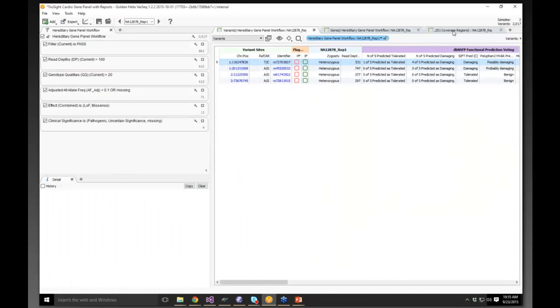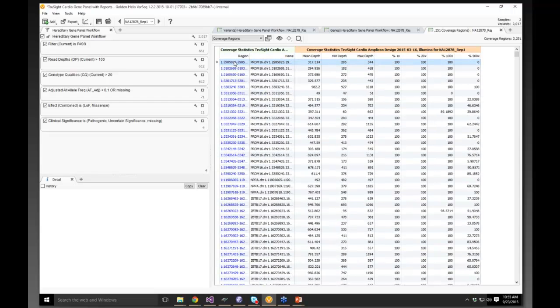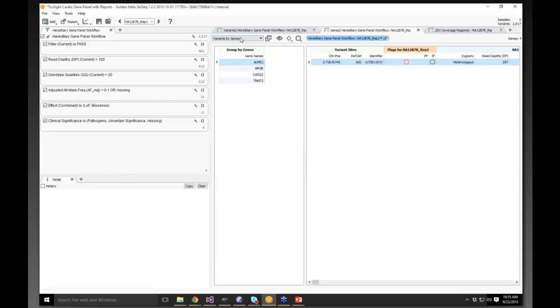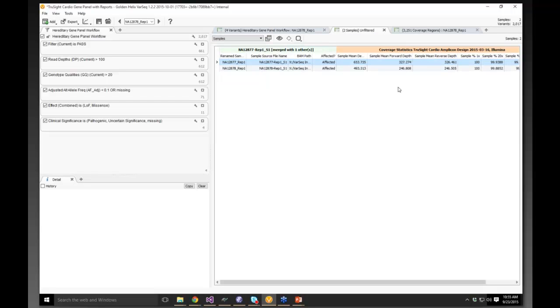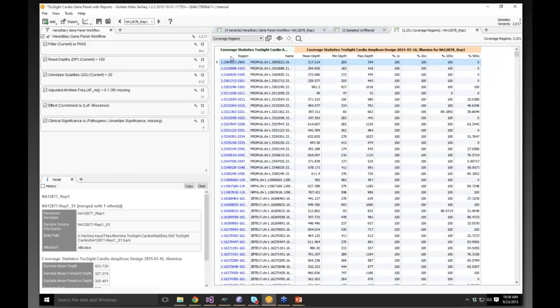And I mentioned this view where you have these coverage computations done on a per region basis, and then this view where we have those rolled up at a sample level. So this is for the 2 samples in my project, their average coverage totally over those regions, etc. And all this is integrated again with our visualization. So now is a good time to demonstrate that.